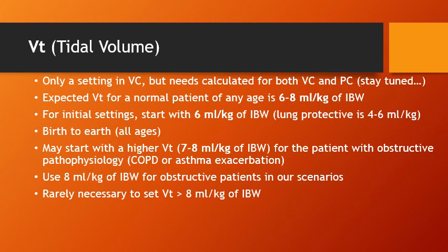So tidal volume is only a setting in volume control breath type. That means you're only going to input a number for tidal volume into the ventilator if you've picked volume control breath type. But we still need to calculate a tidal volume for both volume control and pressure control breath types. And we'll talk more about why we need a tidal volume calculated for pressure control later. But for now, just know that it doesn't matter whether you're using volume control or pressure control. Both of them require you to calculate a tidal volume for the patient.